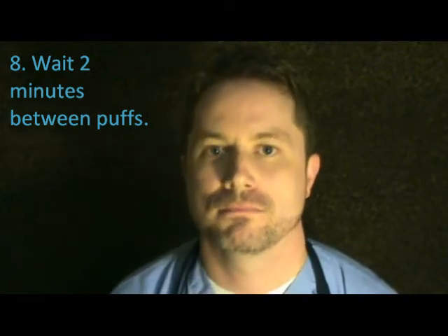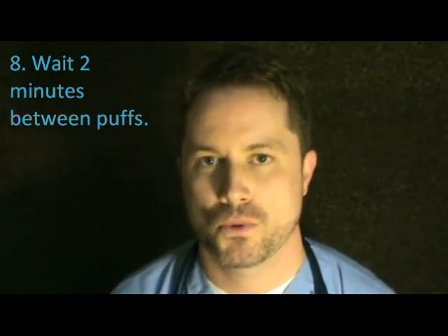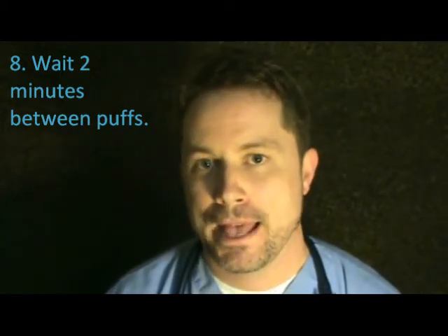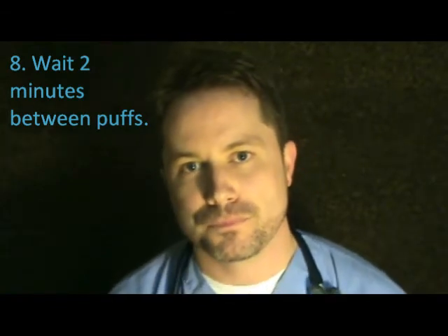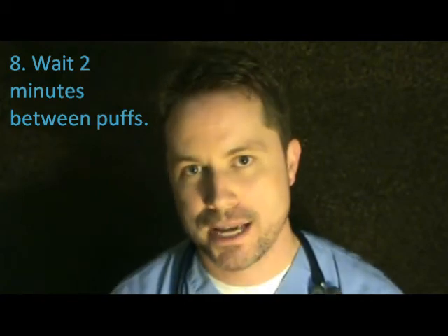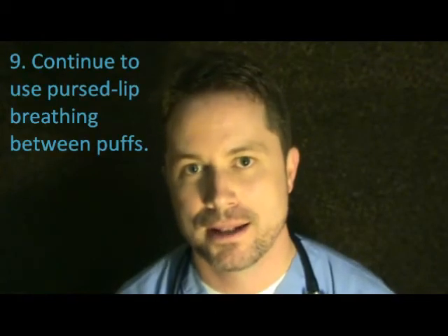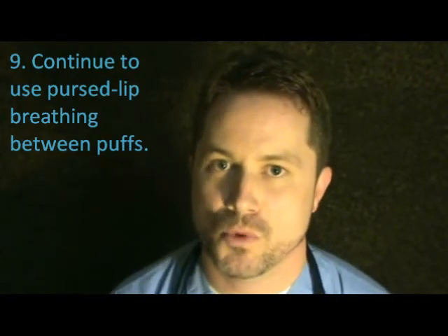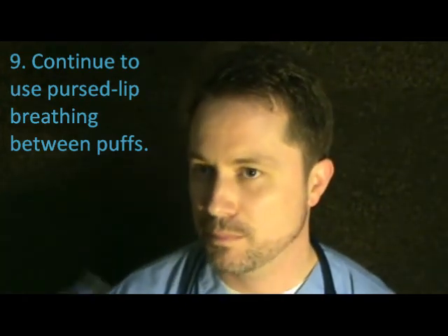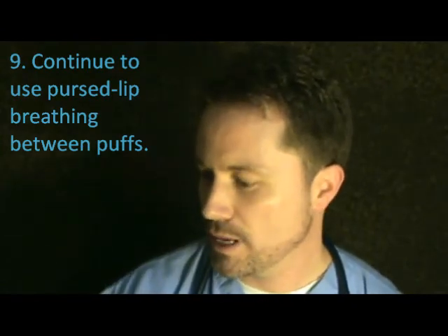That's your first puff. Now between your first and second or any subsequent puffs, use your pursed lip breathing, shake your medication, and wait at least 2 minutes between puffs. If you immediately put it right back in, that first dose isn't going to have been able to open your airways, so the second dose can get even deeper in. If you wait a couple of minutes, that first dose will allow the second dose to get that much deeper into the lungs, making your treatment that much more effective. So pretend it's 2 minutes. It's time to do it again.